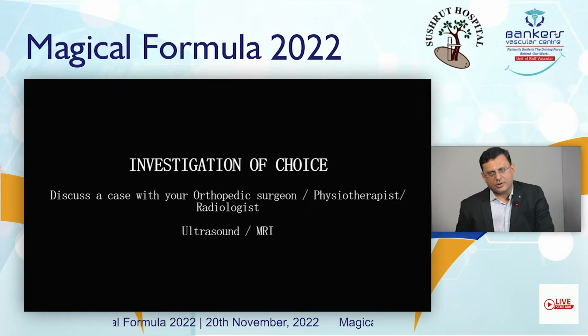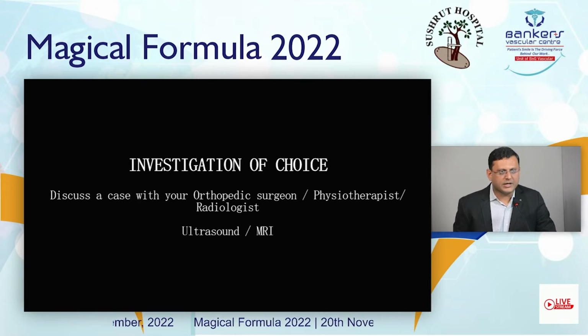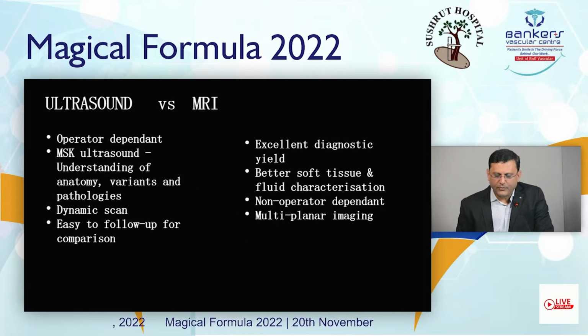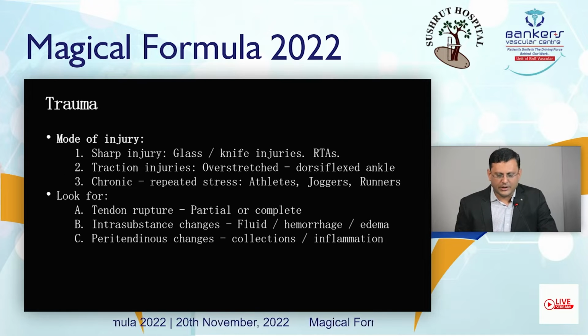Always it is better to discuss the case with the orthopedic surgeon or the physiotherapist or the treating interventional radiologist before doing the scan, so that we can decide which is better for a given patient and do accordingly. As I said, both have their pros and cons, and we need to decide which would be the better modality for a given patient or a given condition.